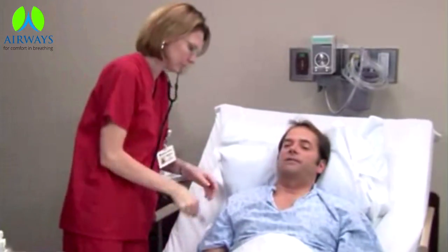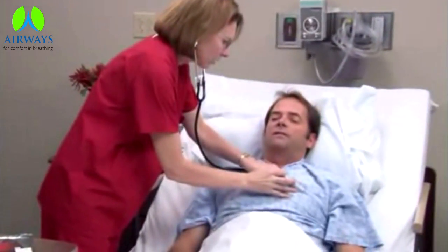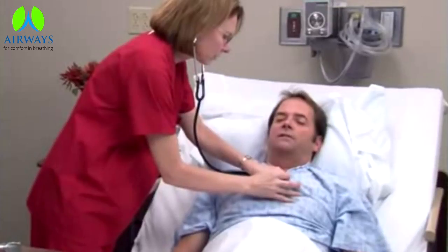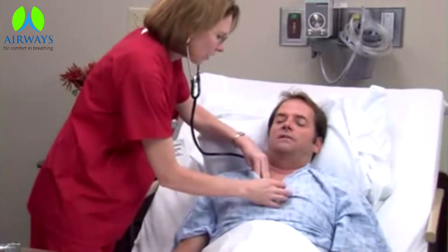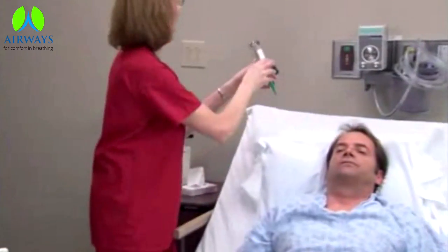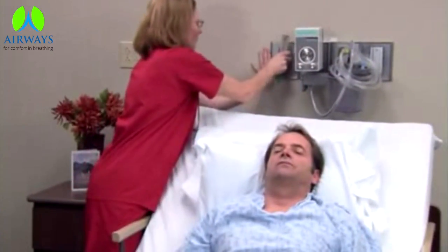Check the physician's prescribed oxygen delivery method and oxygen flow rate. Attach a flow meter to the oxygen source and connect it with the delivery device using oxygen tubing.